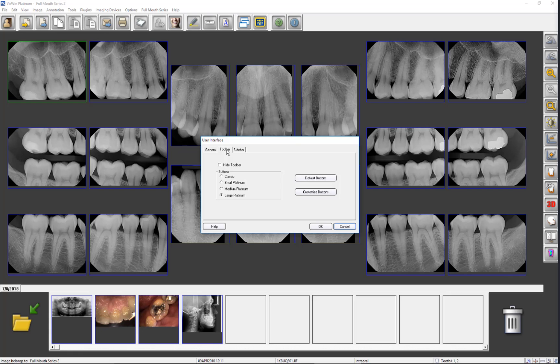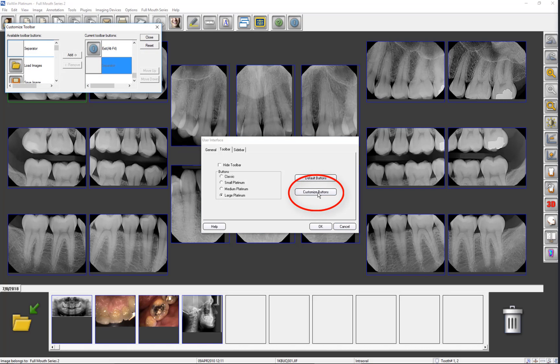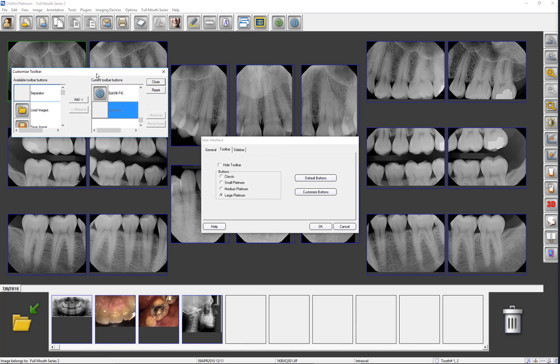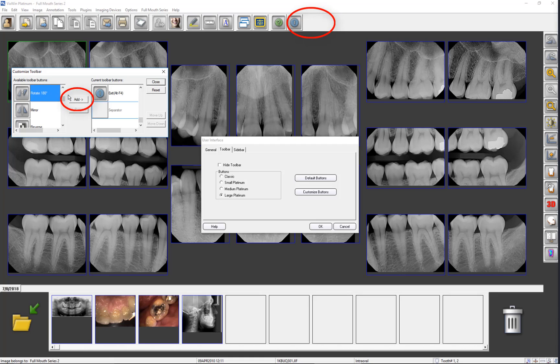When in the Toolbar tab of the User Interface, you can click the Customize button if you would like to rearrange, add to, or remove the button icons from the toolbar. When an available toolbar button is clicked and then Add is clicked, it will appear on the toolbar. Let's click on Rotate 180 degrees and click Add. You see that the button has been added to current toolbar buttons and placed on the toolbar.